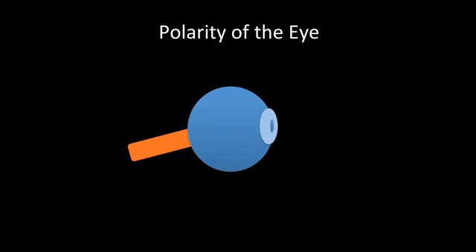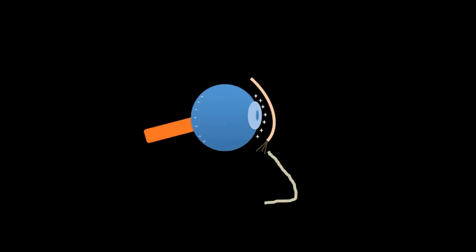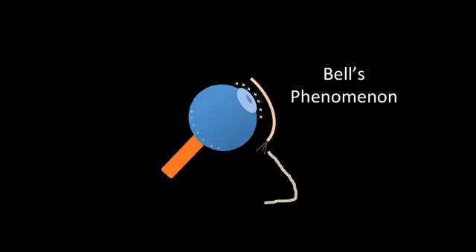One of the most commonly encountered entities on an EEG recording is an eye blink, and so I will review this briefly. We have to think about the eye as a dipole with a polarity. There is the retina and the cornea. The retina is negatively charged, and the cornea is positively charged. If we think about something as simple as an eye blink, in this crude diagram, when the patient blinks their eye, the eyeball moves upward into the head, a phenomenon known as a Bell's phenomenon.